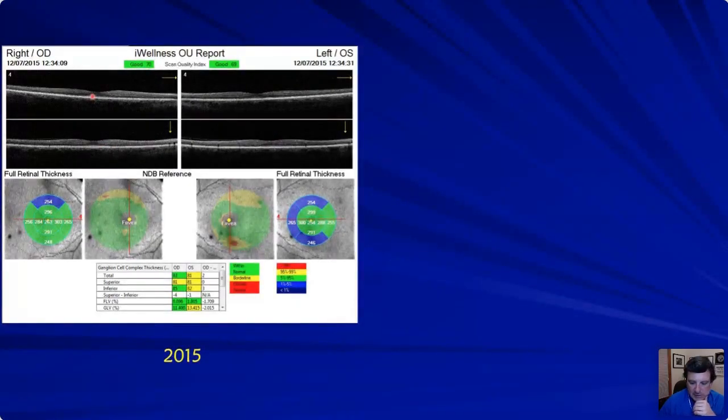So we just said, you know what, this yellow, red, blue disease is totally normal. Now look at this one here, guys. Point this out. Look how this is blue. 265, and over here, 265 green.